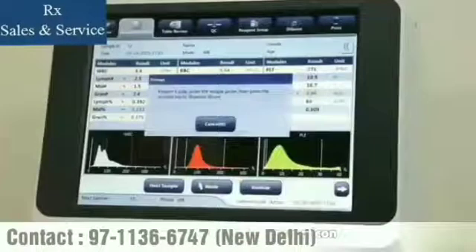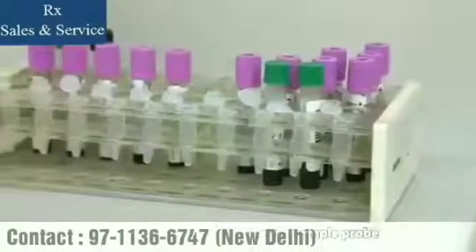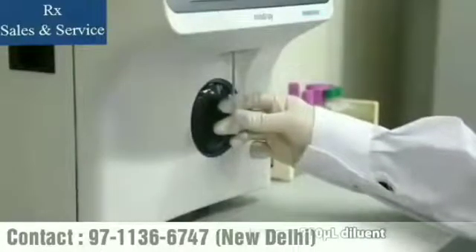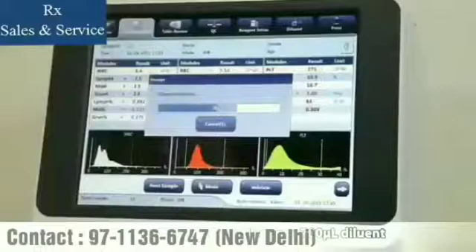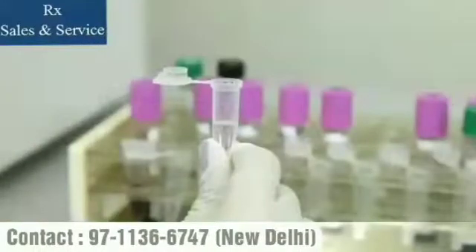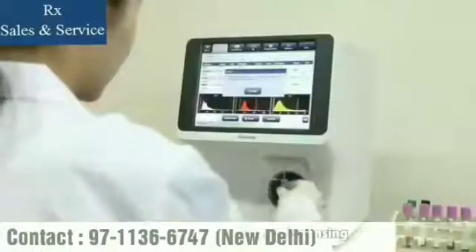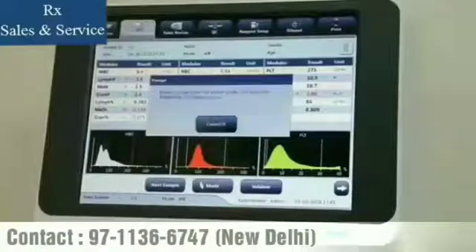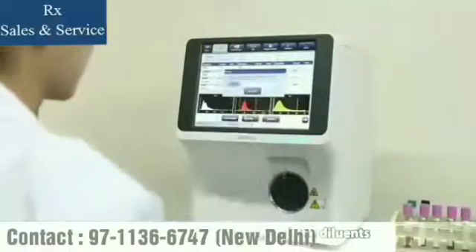Click the dilute dispensing icon, then present a clean tube to the sample probe. Press the aspirate key to dispense 700 microliters of diluent. To continue with diluent dispensing, repeat these steps. Click Cancel after preparing all the diluents.